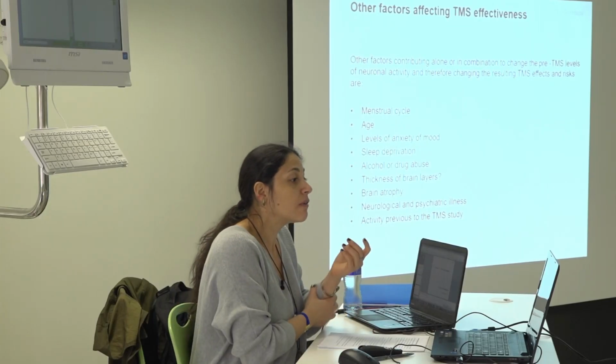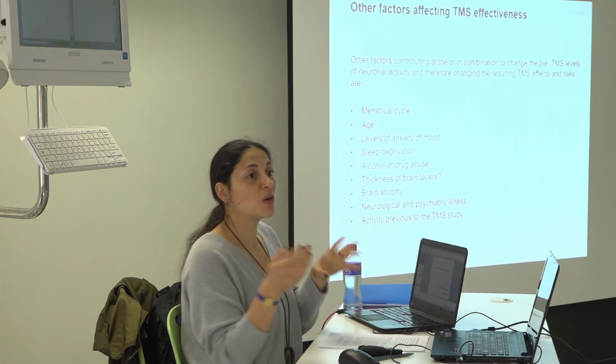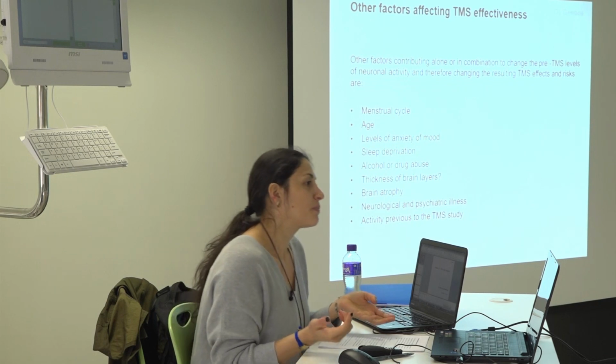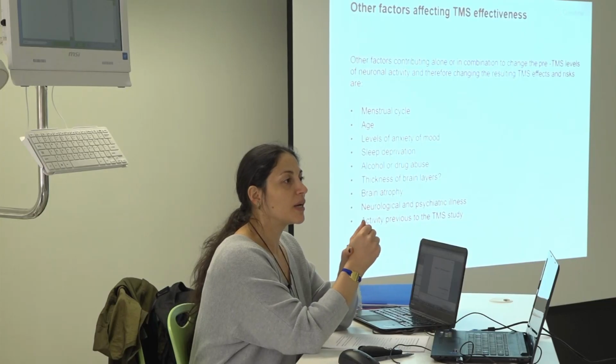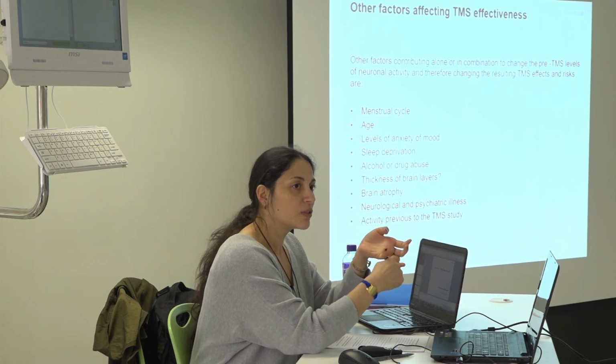So probably the level due to sleep deprivation is not known, but it was reported. So if you have someone who has not slept, don't measure. I normally, when I have my participants, we keep an eye on this. How many hours did you sleep? How many hours do you sleep normally? That's very important to know.